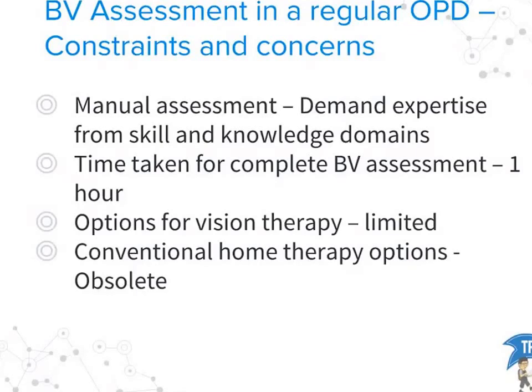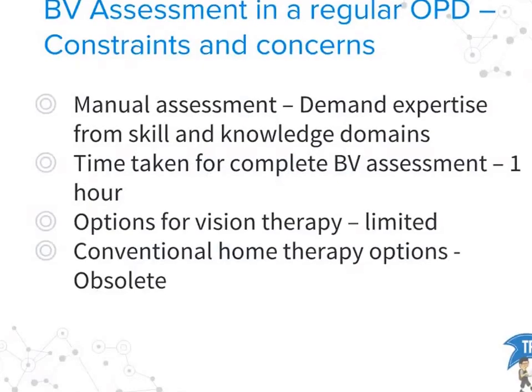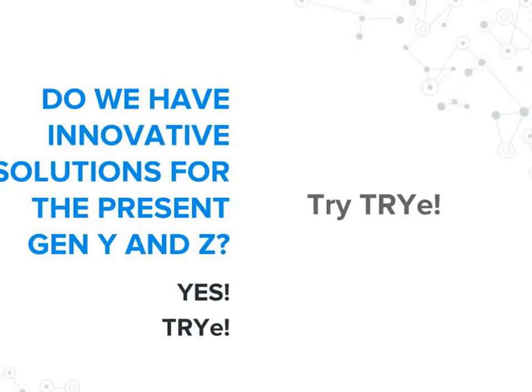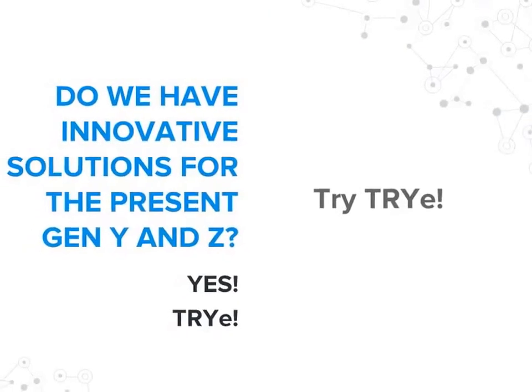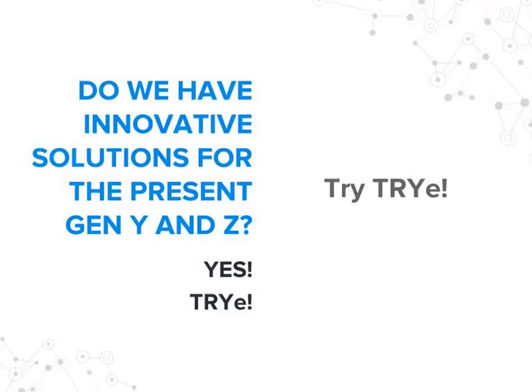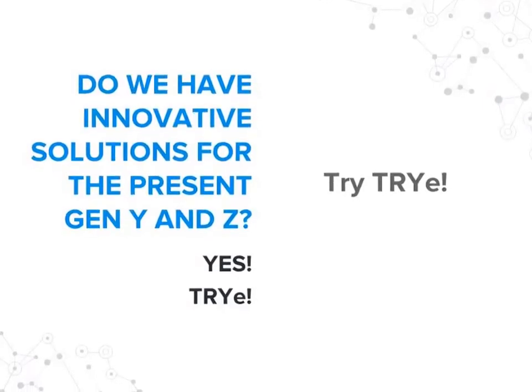Okay, the assessment is done. What next? When I'm thinking of vision therapy, currently the options are very limited, and conventional home therapy options such as pencil push-ups and CAD cards have become obsolete and boring. Especially thinking about the present generation Y and Z who are tech savvy, who want everything in the form of technology, we must definitely think of an innovative solution to address this. Yes, and that is what TRYe is all about.